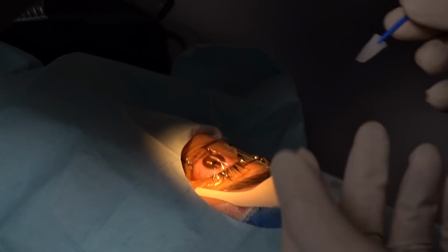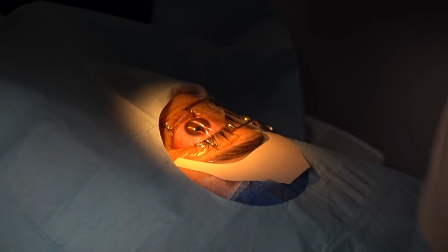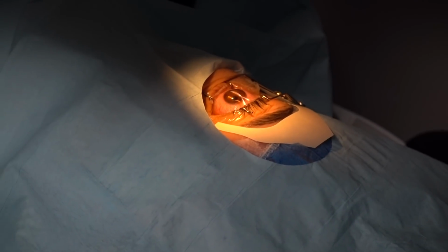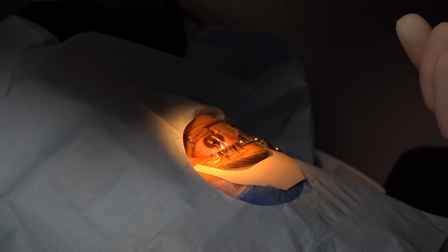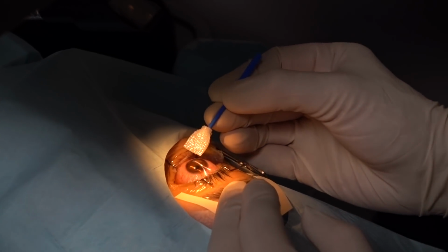And you see that that thing sticks back by itself. You would think that we have to do like stitches or suture or glue or something, but we don't. Her natural body is doing all its work. Wow. It's amazing how fast the body heals, huh? Wow, that within minutes. Amazing.